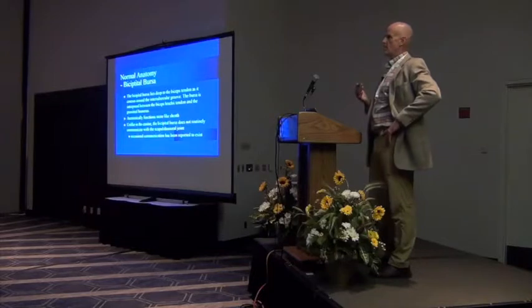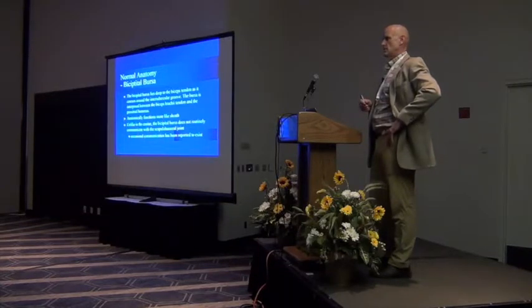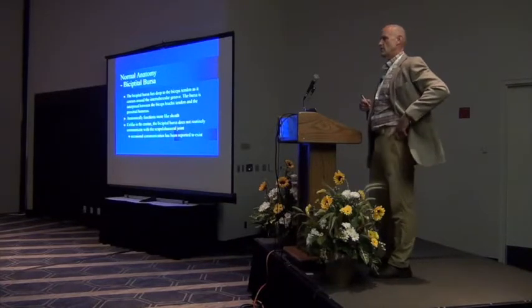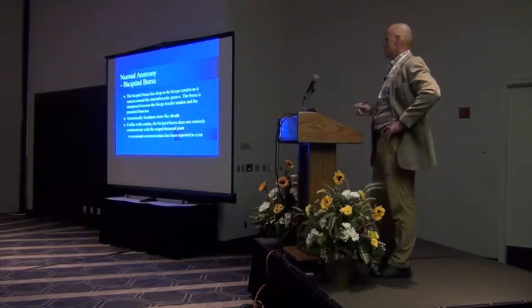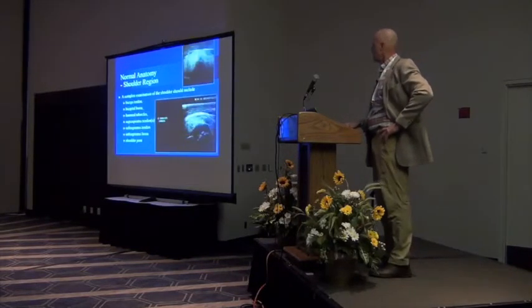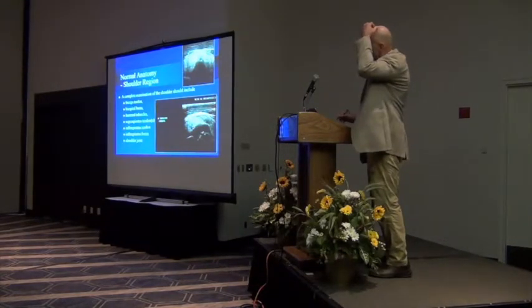And these horses are not necessarily that uncomfortable. So that's another good indication to stick the scan head on there on a horse that's starting to develop some swelling on there, and there may not be necessarily an overt traumatic injury, but we frequently want to look at those areas and be very, very cognizant of the cell content.